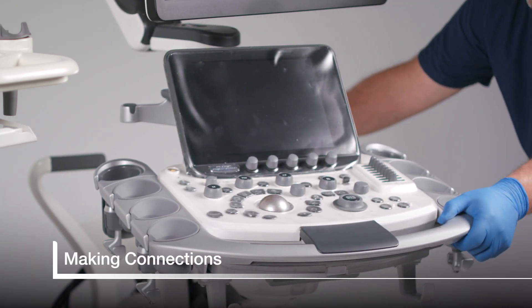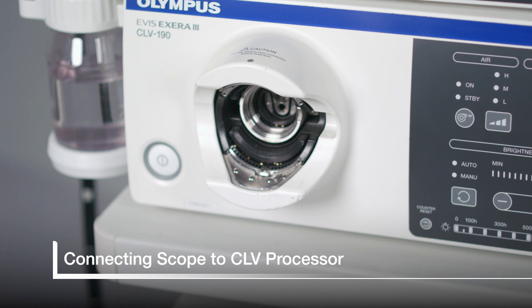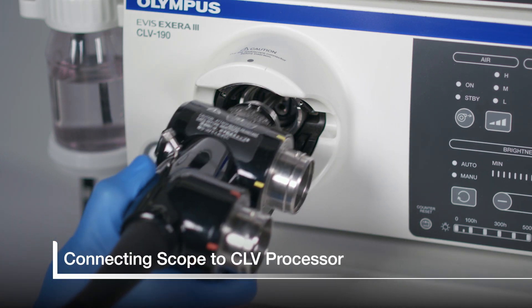As we start setting the room up and connecting scopes, all of the processors should be in the off position. First, plug the echo endoscope into the CLV processor.